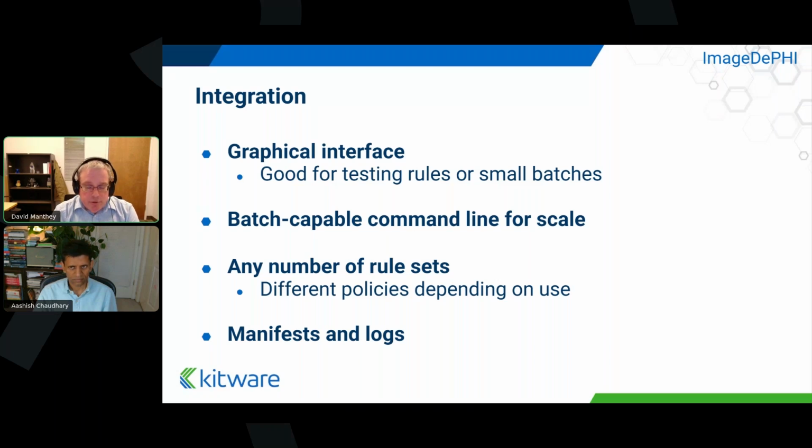So the program is designed to be batch capable from the command line, so you can do this at scale. You can do this just from a command line prompt to try it out, or it's intended to be scripted in this sort of Linux philosophy way, though it works just fine in Windows and OS X. And you can have any number of rule sets, so different policies depending on use and sources. You may know that for this set of data you need to remove the macro images, but for this set you can keep them. Or you might say for this particular case, we want to do something different. And so that integration is critical.